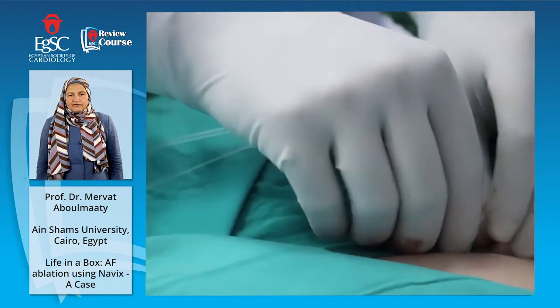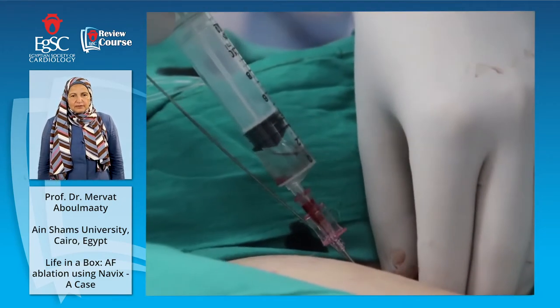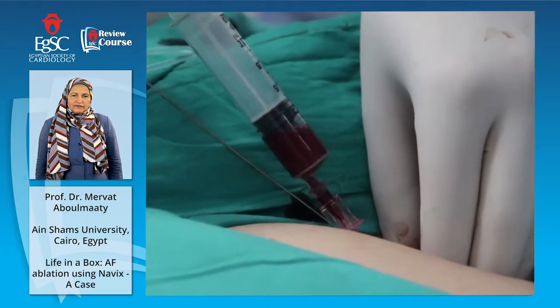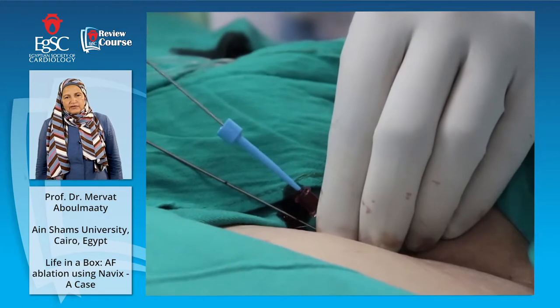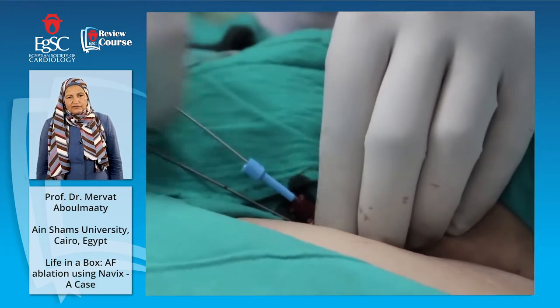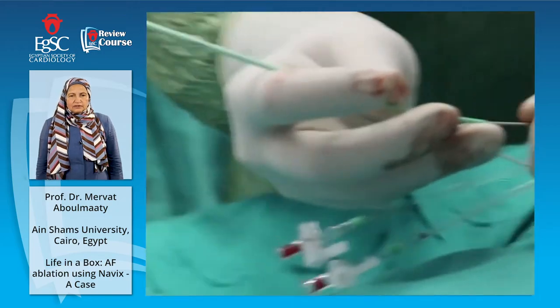Here we start with the left femoral vein puncture, as you see, anterior puncture, guide wire, another puncture with one of our excellent fellows, Dr. Alfie. Yes, he will get the puncture and he will deliver a guide wire into the left femoral vein.